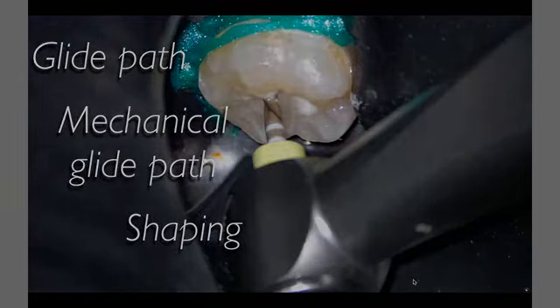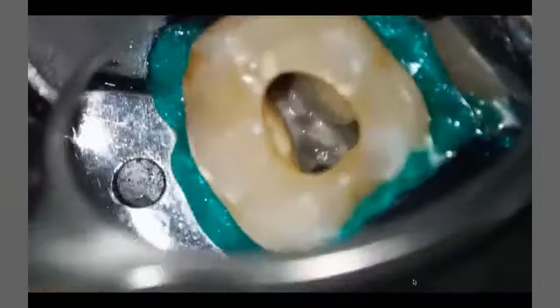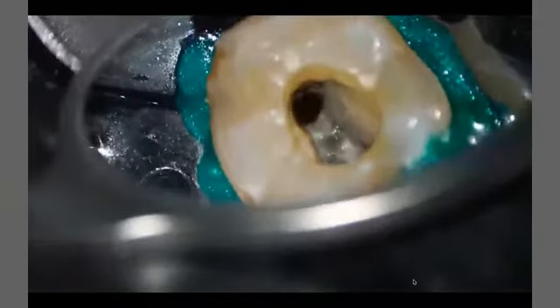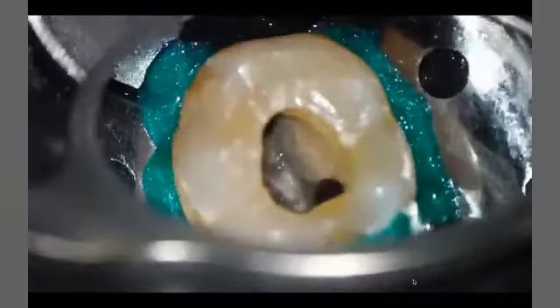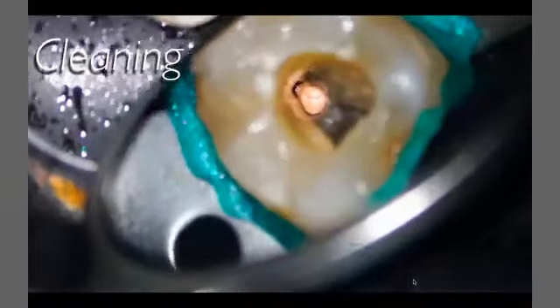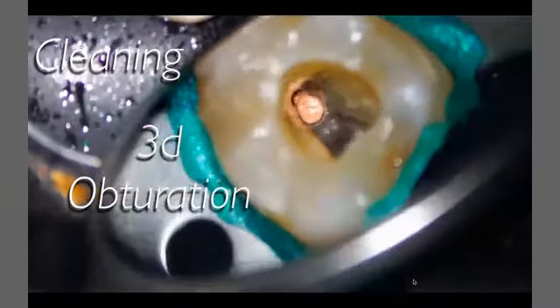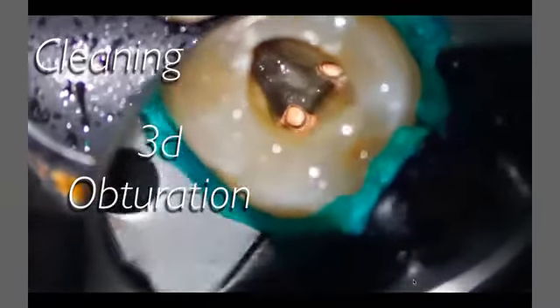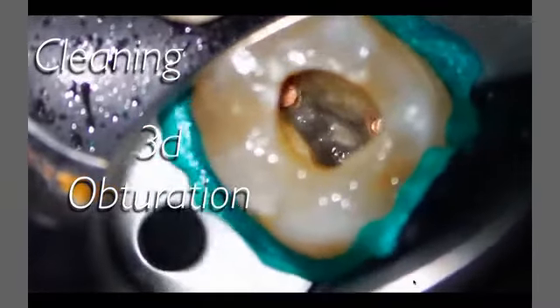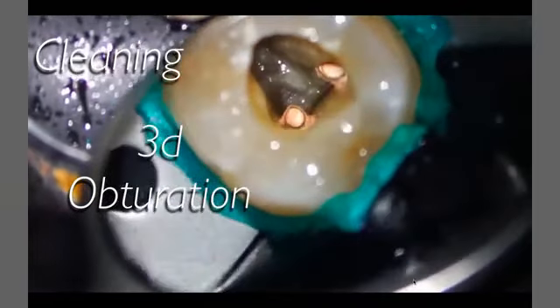The obstacles are only on the coronal part. We have to clean the root canal, activation, and now you can see here the floor map colors. Look at the difference. We have different colors: on the axial wall we have bright dentine, and on the floor map we have the dark dentine. So the floor map is there, we just have to search for it. The colors are there. We just have to magnify as much as we can, dry as much as we can, and remove the bright dentine and the calcification.